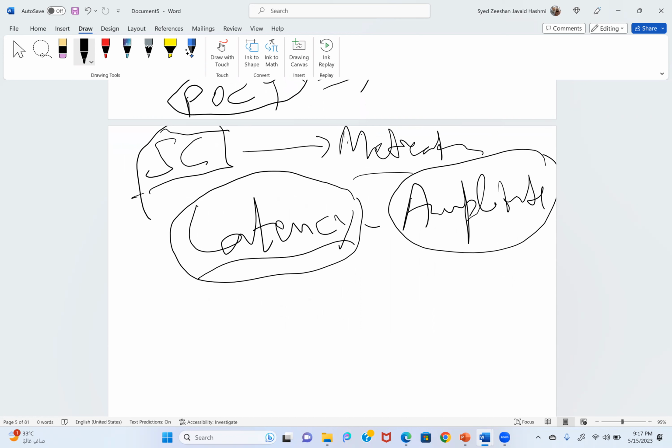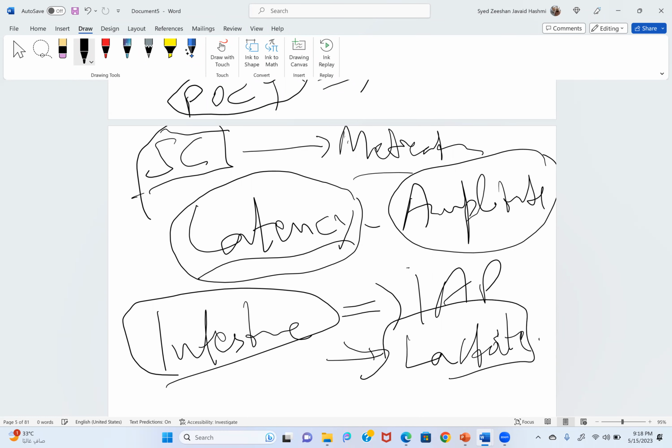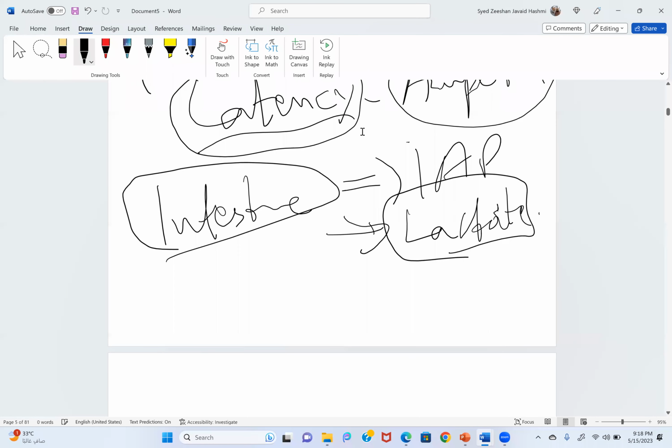Okay, what about intestines? Is there any test by which you can monitor the perfusion of the intestine? Sir, again, intra-abdominal pressure. Okay, there is another thing, lactate. Usually lactate will go up, because ABGs as a point of care testing give you a lot of information, not only about the cardiovascular system, respiratory system, and ischemia.